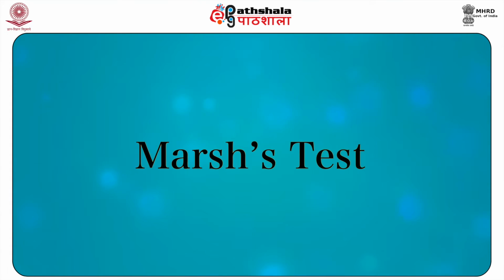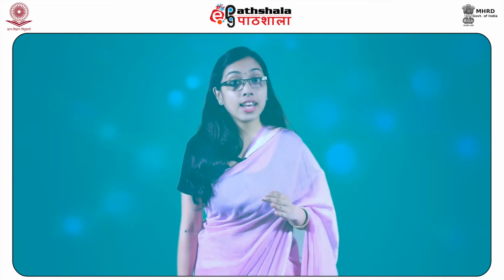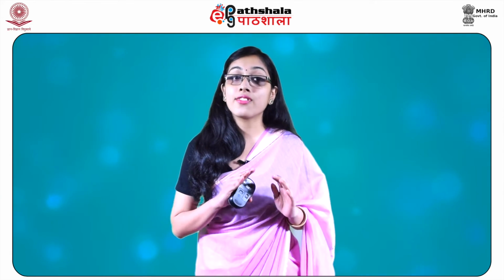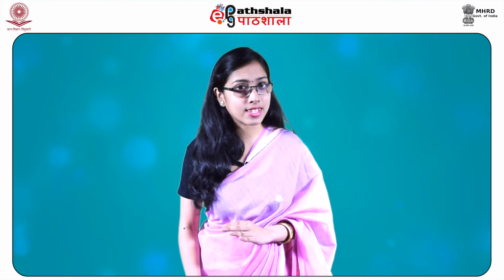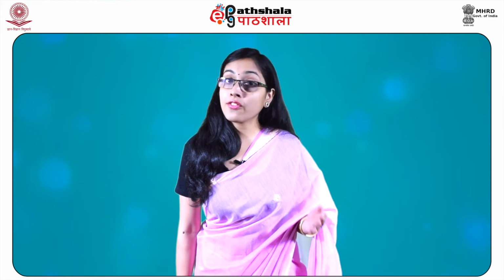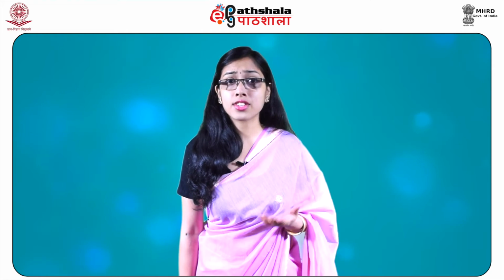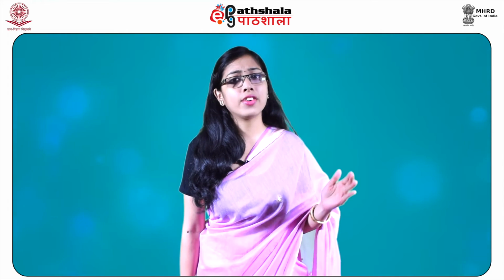Third one is the Marsh test. The electrolytic Marsh-Berzelius test is done over the conventional zinc sulfuric acid method for the evolution of nascent hydrogen, as these reagents are often contaminated with arsenic.